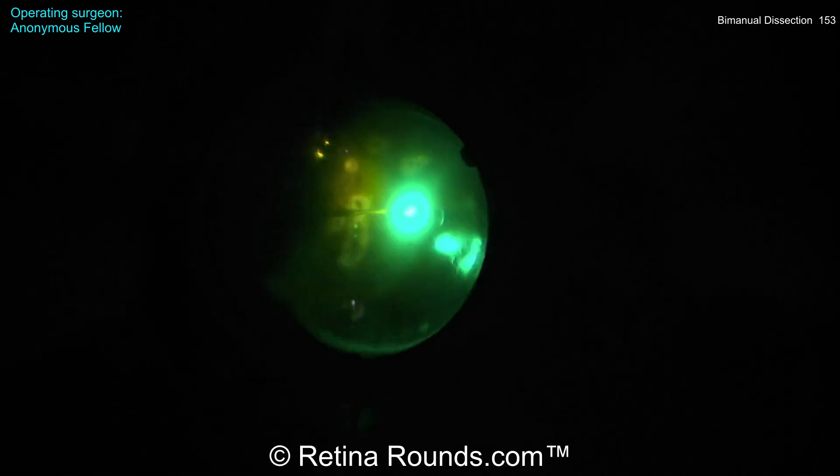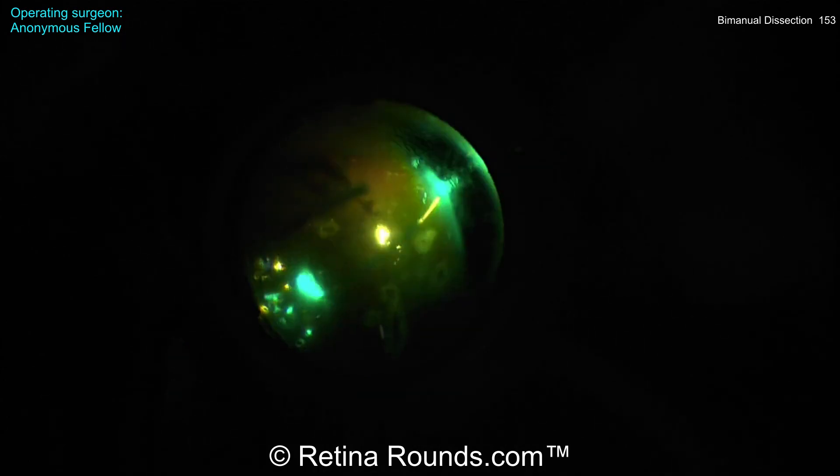However, the hyaloid looks to be very nicely elevated off of the retinal surface. All the residual traction has been relieved and now some laser is being performed around these breaks and some PRP is being performed to the retinal periphery.